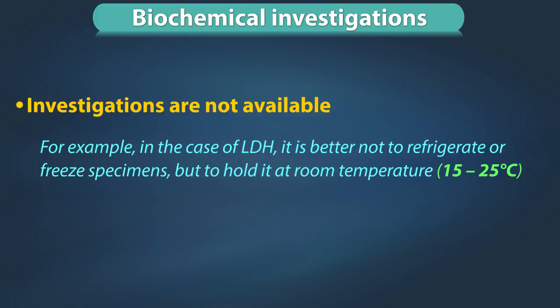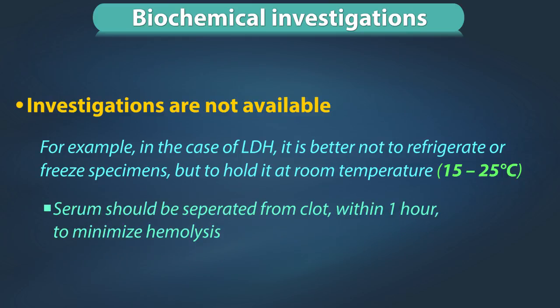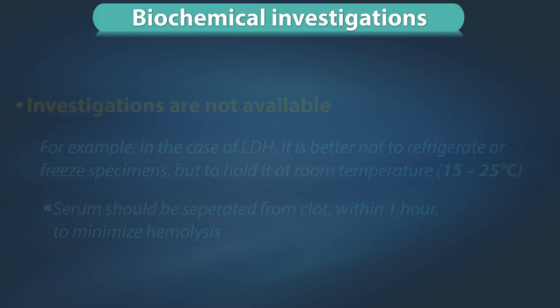For example, in the case of LDH, it is better not to refrigerate or freeze the specimen, but to hold it at room temperature at 15 to 25 degrees centigrade. Serum should be separated from clot within 1 hour to minimize hemolysis.